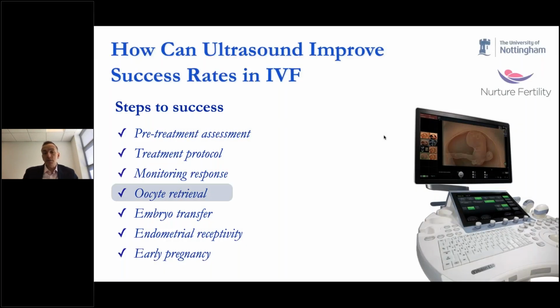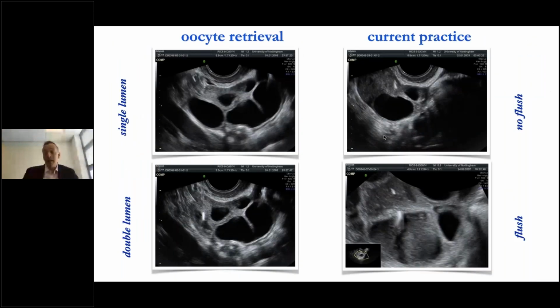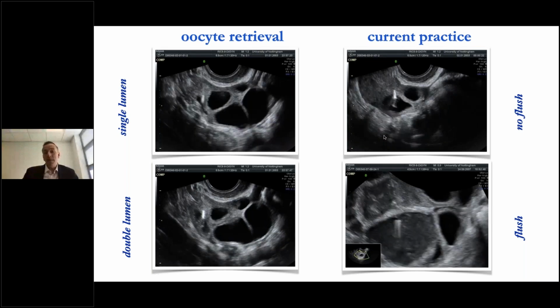I'll just get to embryo transfer and stop at that stage. So oocyte retrieval, for those of you who do IVF, again, a lot of times, should you aspirate or should you just drain? It's taken me many years. I grew up on flushing every follicle possible, and now I flush nothing. Potentially, maybe if we've got 1 or 2 follicles, but really we rarely flush.